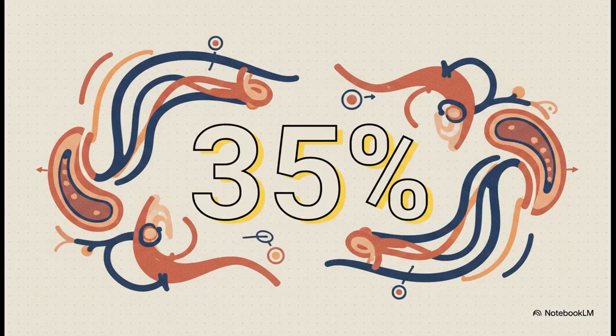So what's our clinical threshold here? Well, here is your hard clinical rule. An asymmetry ratio of over 35% equals saccular loss or hypofunction. And hey, if the response is absent altogether, that's obviously a massive red flag too.